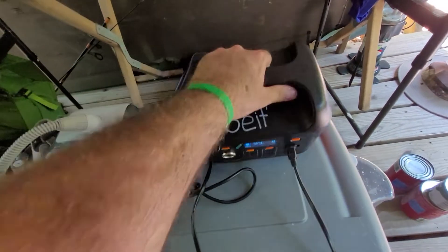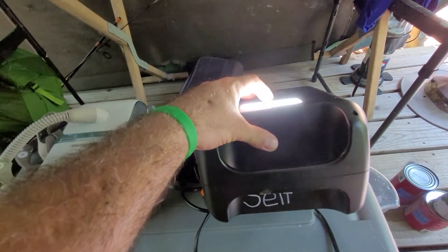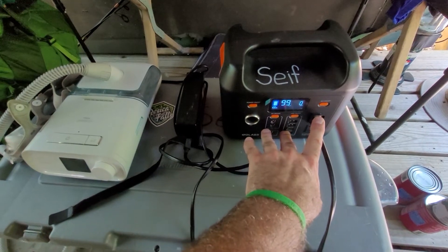It also has a built-in light on the back — nice and bright. It can be used to signal or just as a regular light. You can also choose which one of these power banks you turn off and on, which helps to conserve some of the power.